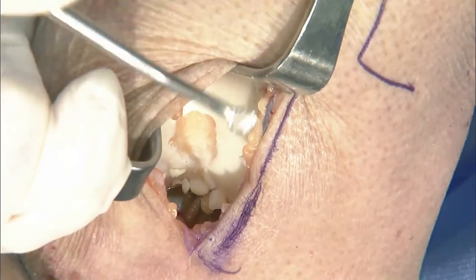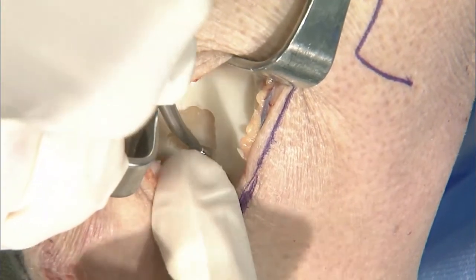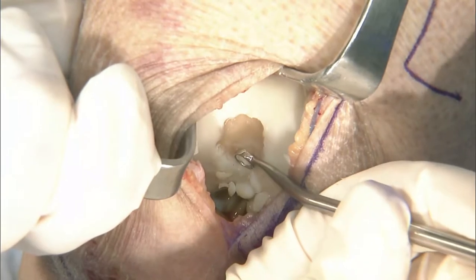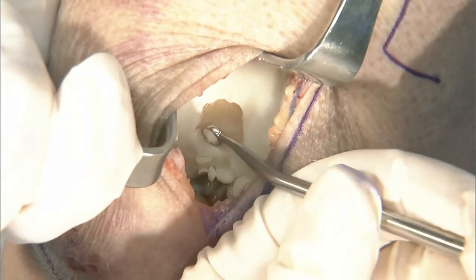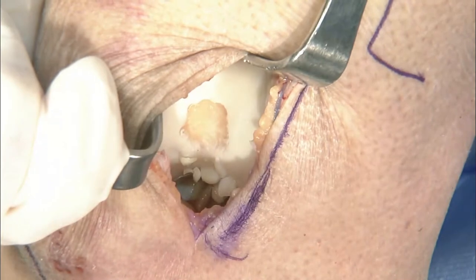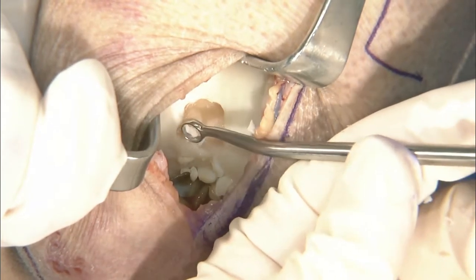We have a paper coming out in AJSM here in a bit about removing the calcified cartilage layer. And we had fellowship trained surgeons and essentially we were all really bad at predicting whether or not we saved it or removed it. But I think that the biggest thing is that if you start getting so deep that you can visually see the cancellous bone and you start to see that architecture, you're getting too far in that area. And if you have a tourniquet up while you're doing this, you may not think you're as deep, but that will bleed once you let it down, and that's definitely not ideal. So you want to see that shiny white surface.